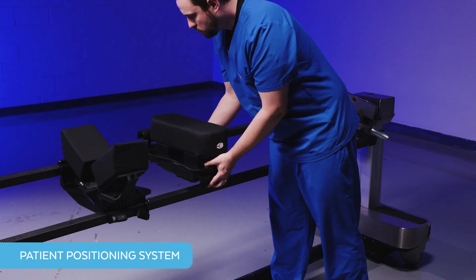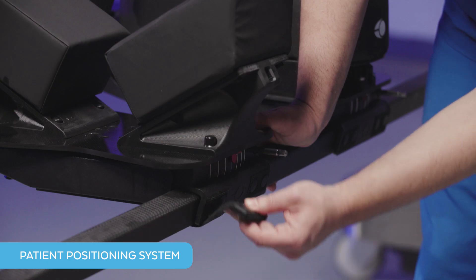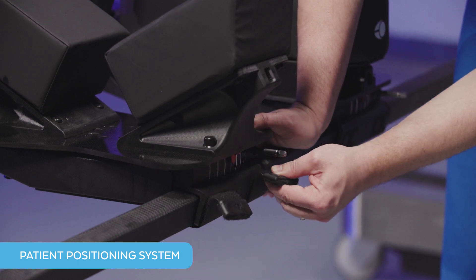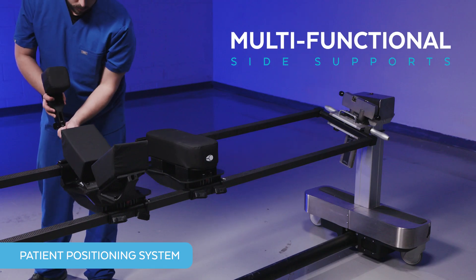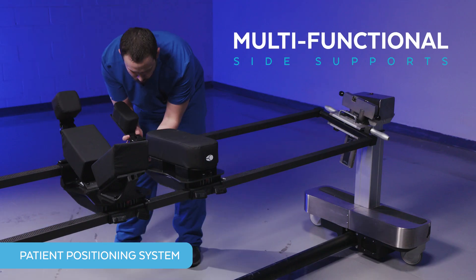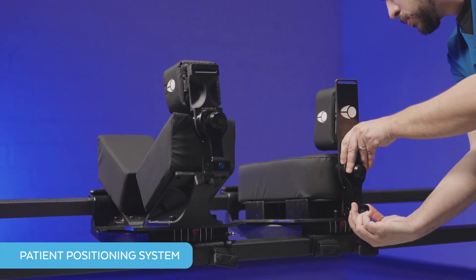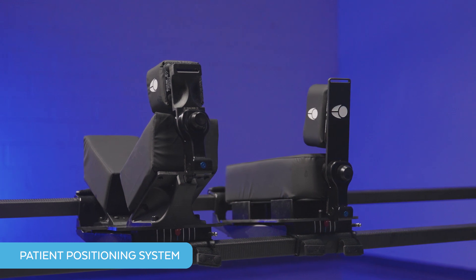The first key component of the Excelsius Prone Lateral Surgical Solution is the patient positioning system. Our dynamic patient positioning system sits on top of a Jackson frame table and is composed of primarily radiolucent materials. There are four primary features to this system. First are the multifunctional side supports, which are pad mounts that can be adjusted to fit the patient anatomy. The pads grip the patient at the chest and hips to resist movement and provide maximum support during the coronal break and tilt.